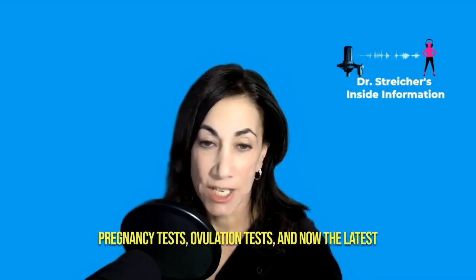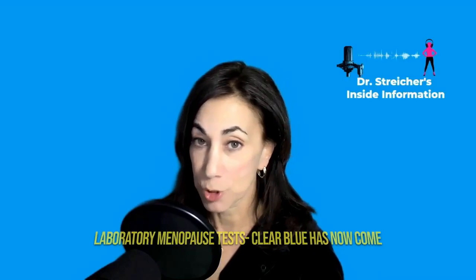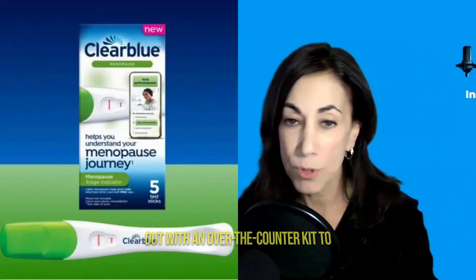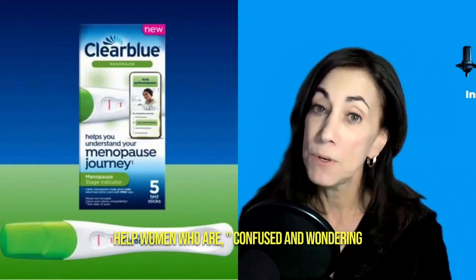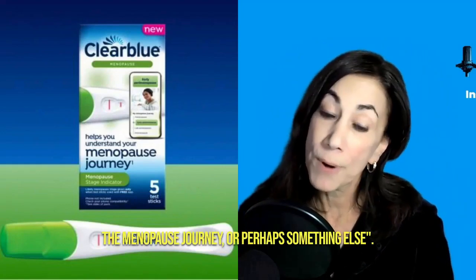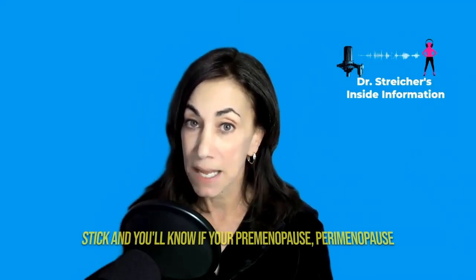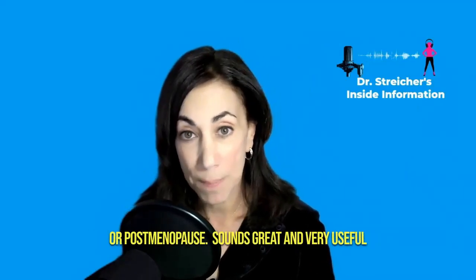Pregnancy tests, ovulation tests, and now the latest in tests you can do in your bathroom laboratory, menopause tests. Clear Blue have now come out with an over-the-counter kit to help women who are, quote, confused and wondering if what you're feeling is the start of the menopause journey or perhaps something else. All you need to do is pee on a stick and you'll know if you're premenopause, perimenopause, or postmenopause.